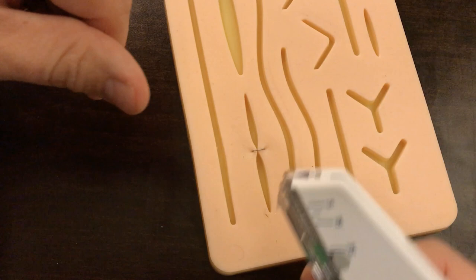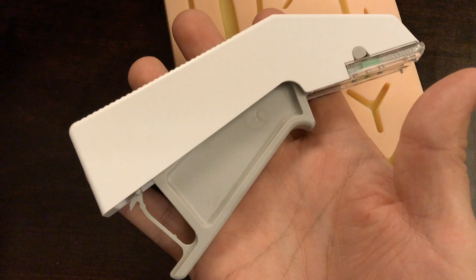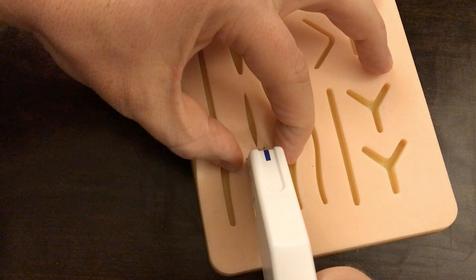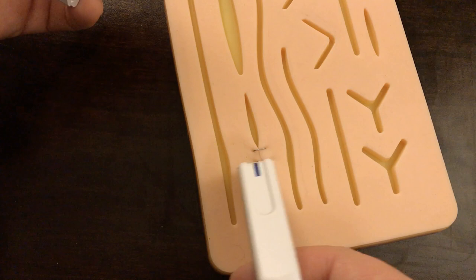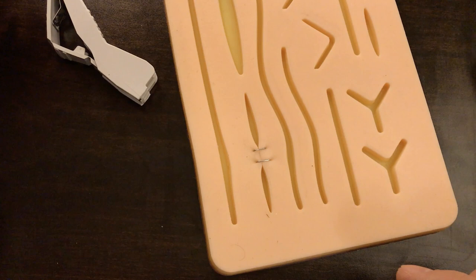With the larger stapler, my angle is going to be flat against the skin. This is the same stapler we used in the operating room and in urgent care settings. I like it because it's a little larger so I can get a better grip. Again, cause the skin edges to be well approximated, then apply firm pressure as you push down and place the staple. You want to make sure the midline of the stapler is right over the middle of the laceration so it's centered — be careful not to be off too far on one side.